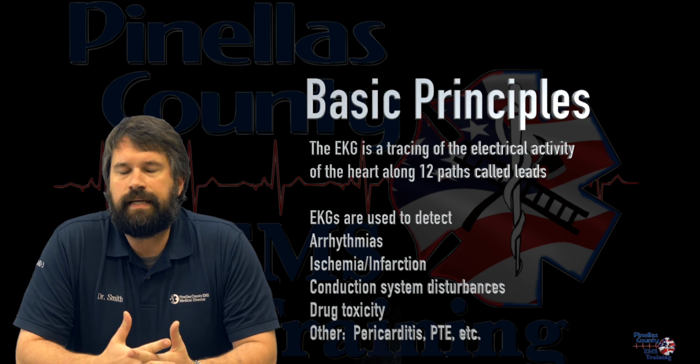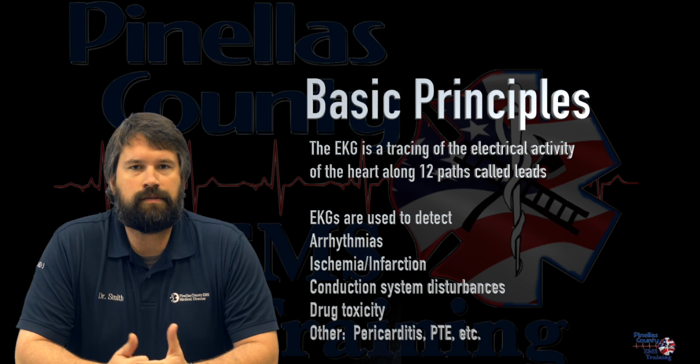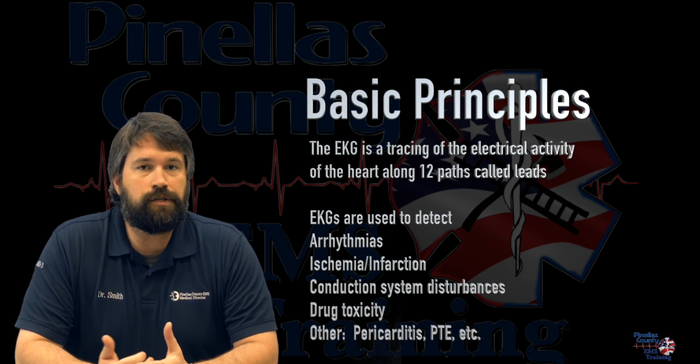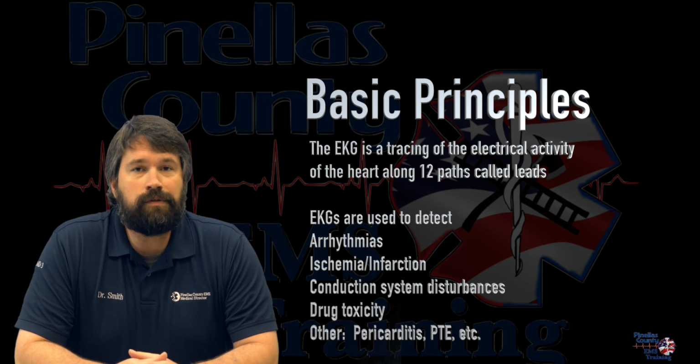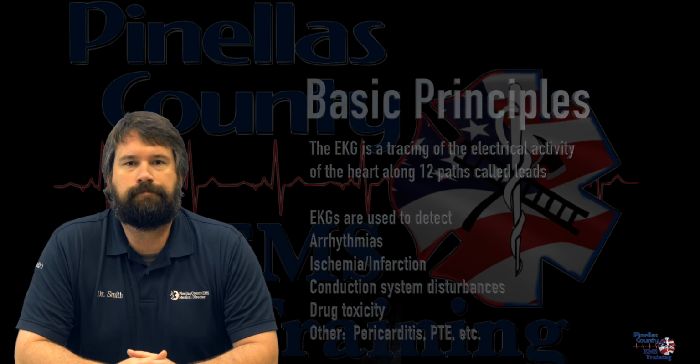So first off, what is an EKG? It's a tracing of the heart's electrical activity along 12 paths or leads. It has multiple uses. It is used to detect arrhythmias, infarctions, or heart attacks, physical damage like with trauma, drug toxicities, many uses in medicine.